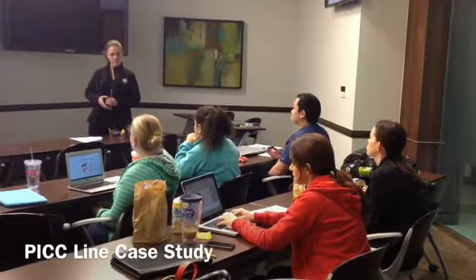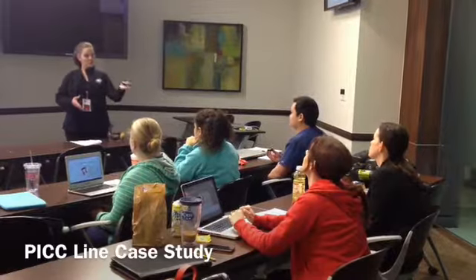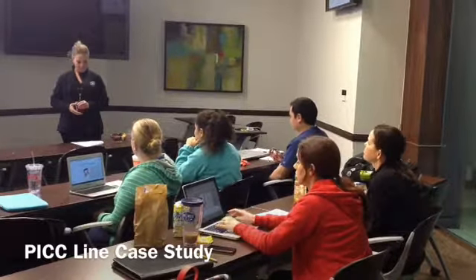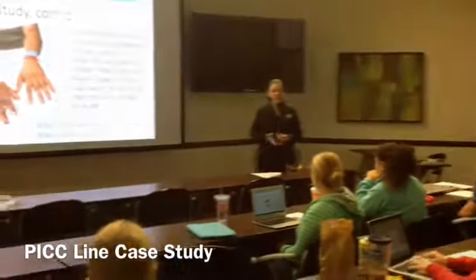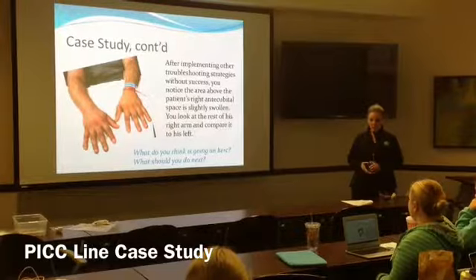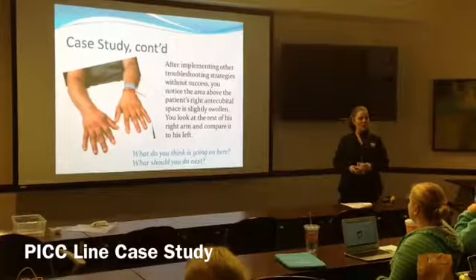Something in the future. Right? Don't use it. Don't use it any further than what? Call the doctor. Call the doctor. Good. So further investigation is going to be needed. May result in a declot, an exchange, or removal and reinserting on the contralateral side.